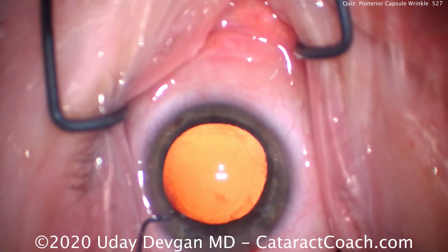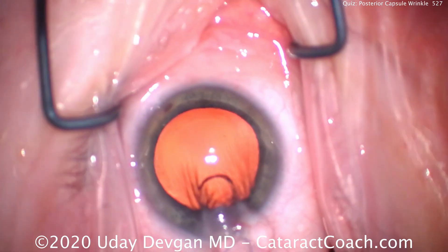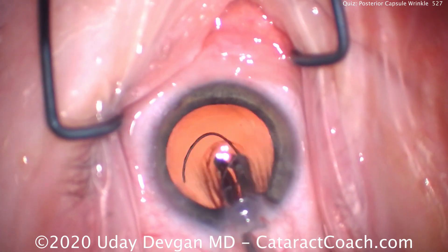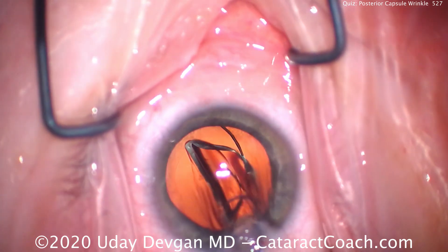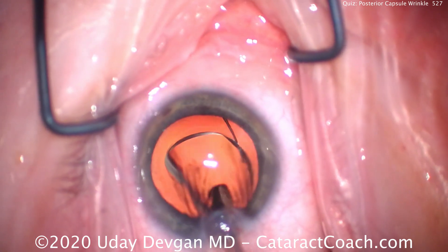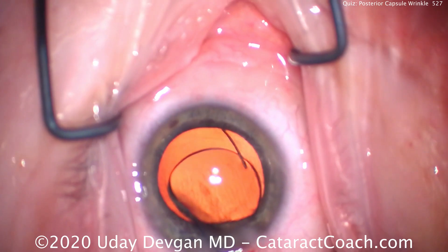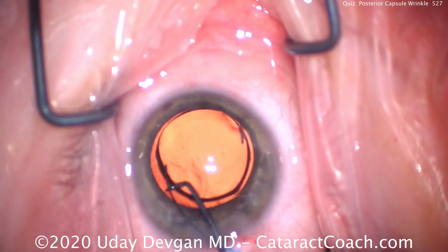This is an interesting case. Let's get right to the IOL insertion. Here comes our IOL — it's a three-piece, monofocal, hydrophobic acrylic lens. We're going to deliver it right there in the capsular bag. Remember, the haptic should be in the anti-S orientation.